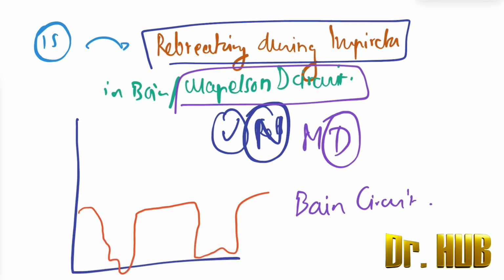So this was all about capnography and very important capnographic findings with their respective diseases.